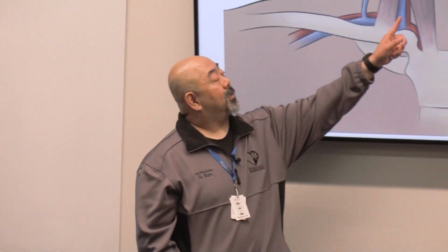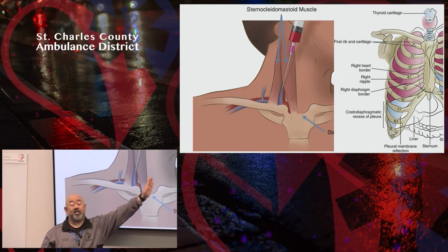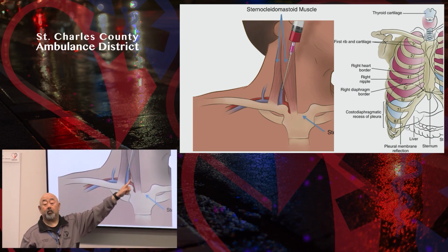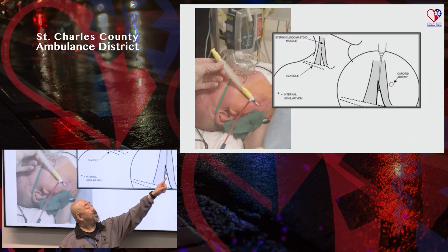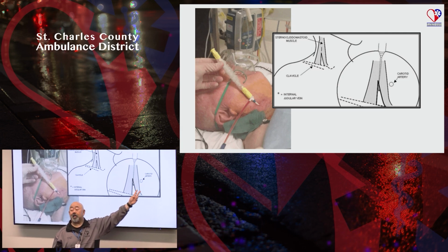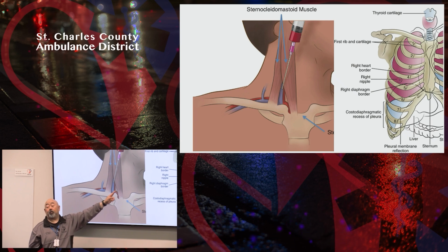So you really need to know how this is placed and what the complications can be. It's not that the carotid artery is lateral per se and separate from the IJ. It's actually right behind it. I know this picture made it seem like the carotid is 3 centimeters away, but that's not the case. In real life, it's just below it.